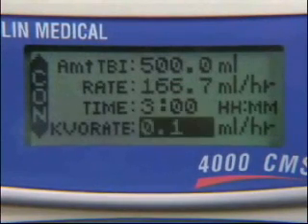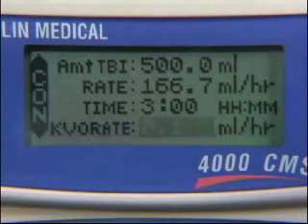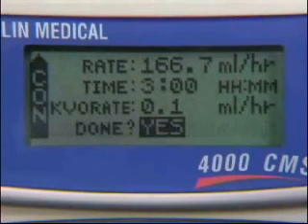The Keep Vein Open rate is used to maintain an open line to the patient using a very low flow rate. The default rate is 0.1 milliliters per hour. Press the Yes Enter button to accept the KVO rate. Press the Yes Enter button to complete programming and then start the infusion using the Run button.